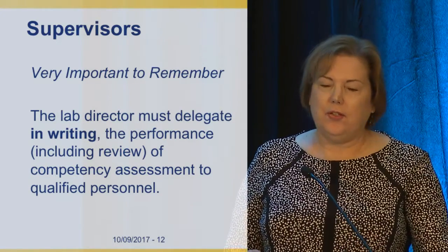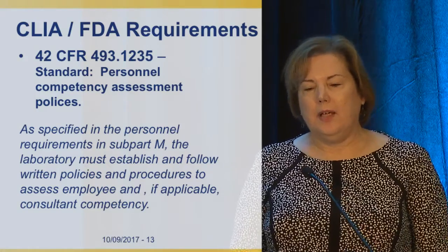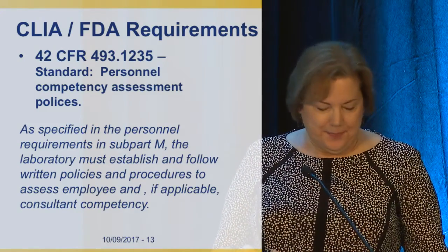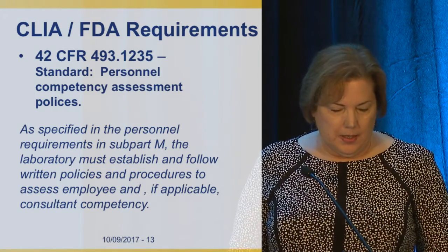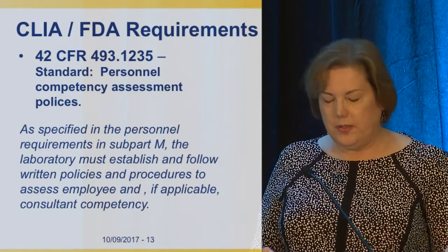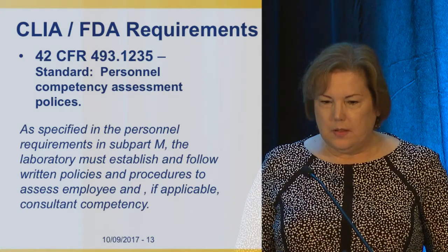So now I'll move on to the CLIA and FDA requirements. I was reading this one day, and I'm like, okay, as specified in subpart M. I'm like, oh, great, now I'm down into the subparts. This is going to be fun. So again, I'm not going to discuss every part of subpart M because not all of it actually applies to competency testing, but there are two parts in Part B of 493.1235 that are germane to this topic.